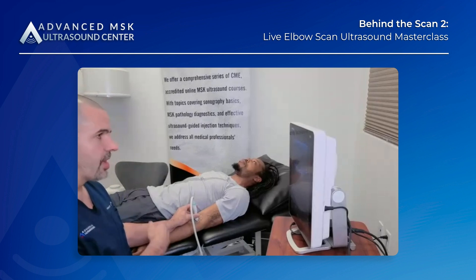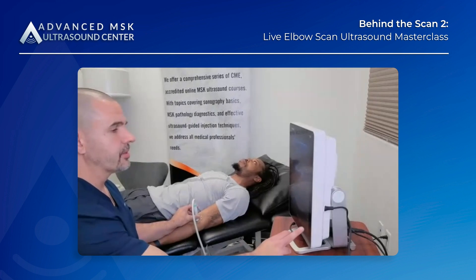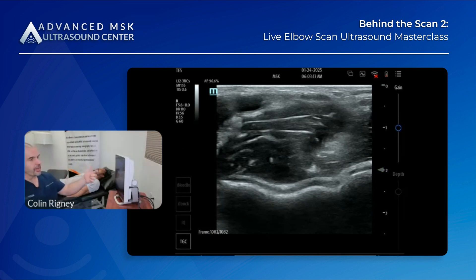As you can see, my probe is positioned cross-sectionally at roughly the antecubital fossa. I'm going to freeze the transducer. Let's start by orienting ourselves — we are cross-sectional at the antecubital fossa. When reading an image, start from the bottom of the screen and fix your eyes upward. The first thing you should see is bone — this bright white cortical line right in the middle. You can see it's kind of double-edged here; this is hyaline cartilage of the distal capitellum. This is our home base in the anterior elbow. The big muscle adjacent to the bone is the brachialis, and on top is the biceps brachii.